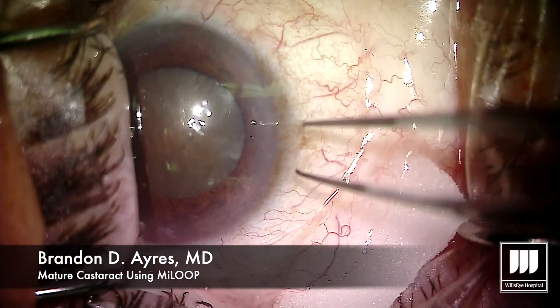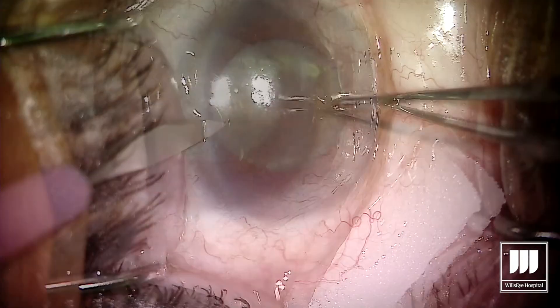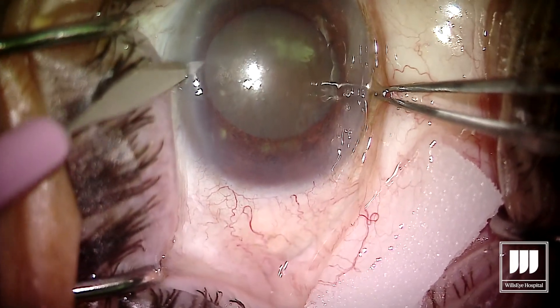Hey guys, a friend of mine asked me to post a video of how we've been using the MiLOOP for our hypermature lenses. So here we go.